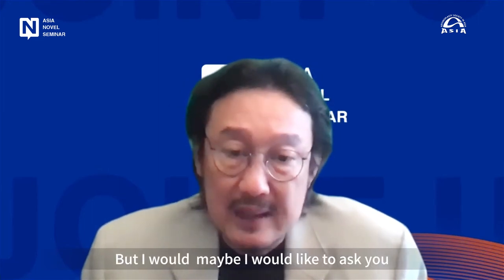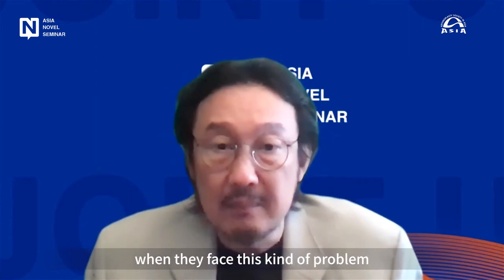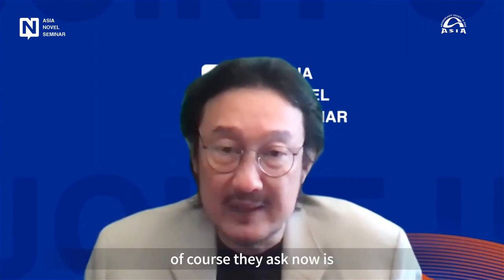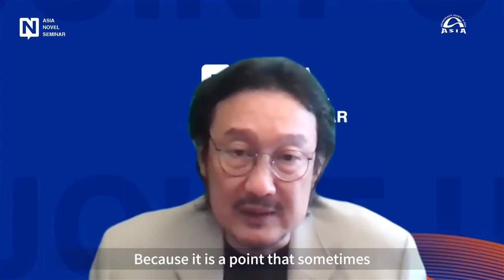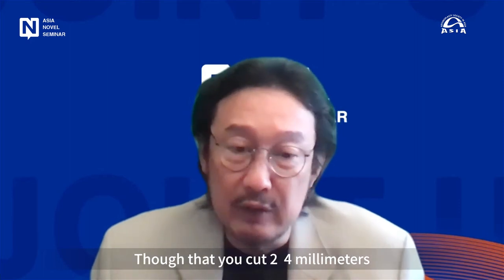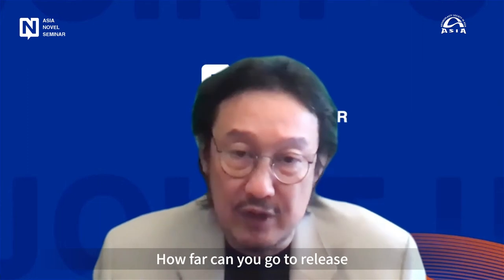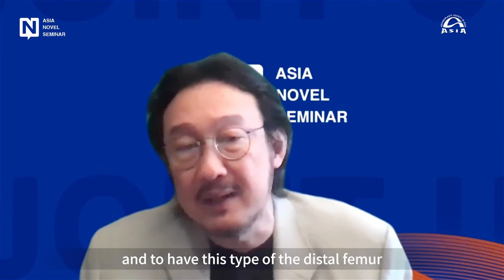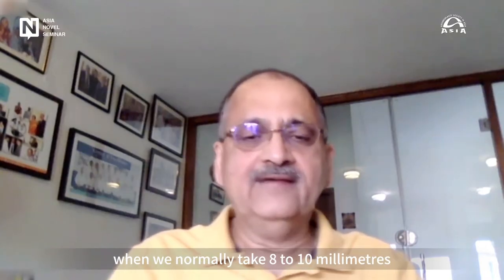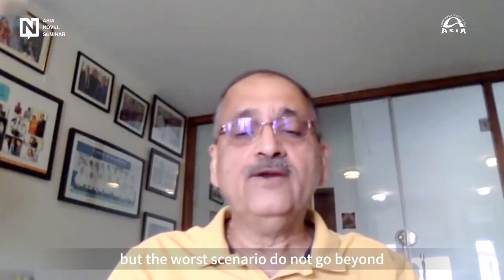But I would like to ask you, for the young surgeons, when they face this kind of problem, of course they ask: how far can you cut the distal femur? Because it's a point that sometimes you cut 2-4 millimeters, what is your landmark? How far can you go to release and to have this cut of the distal femur to make it straight?